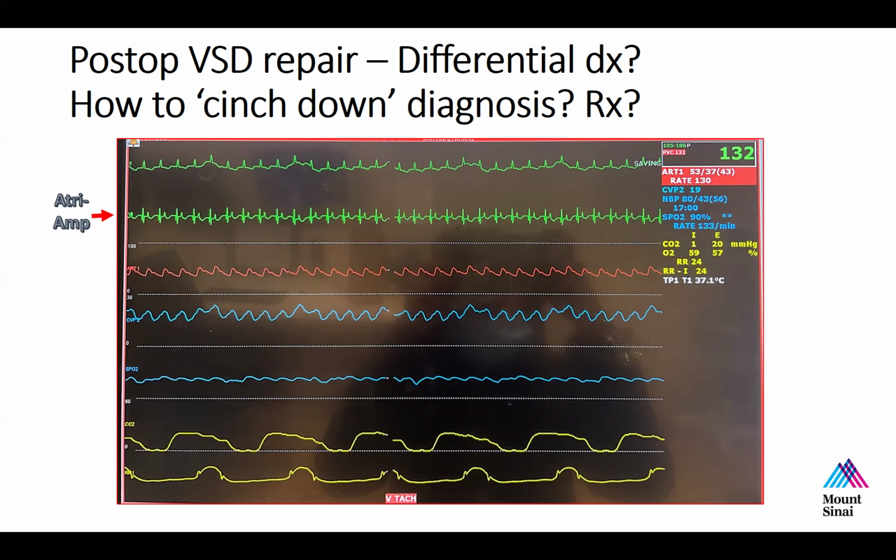So we know there's A wires because there's an atrium. So I think that I would be comfortable watching it, and if the patient became unstable, since we have the A wires in place, we can atrially pace if they become hemodynamically unstable. Okay, I certainly think that is not unreasonable. It would not, however, be my choice, and I'll tell you why.